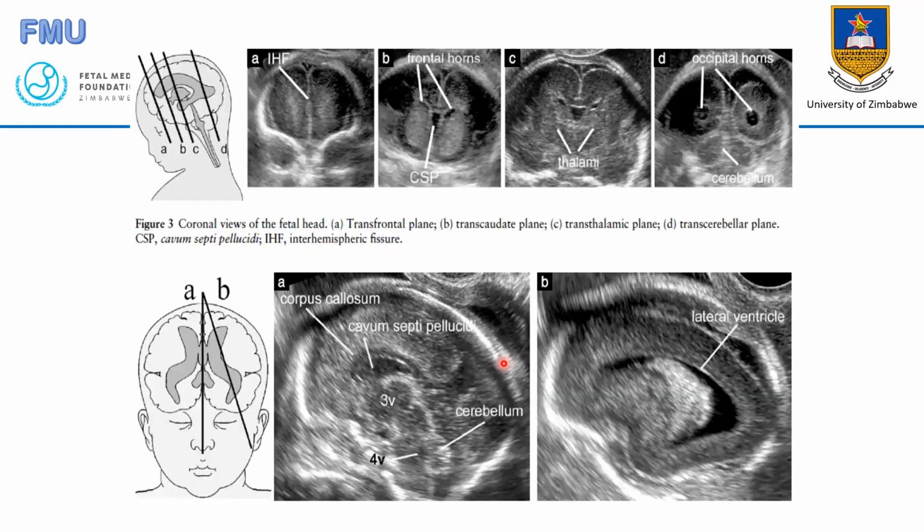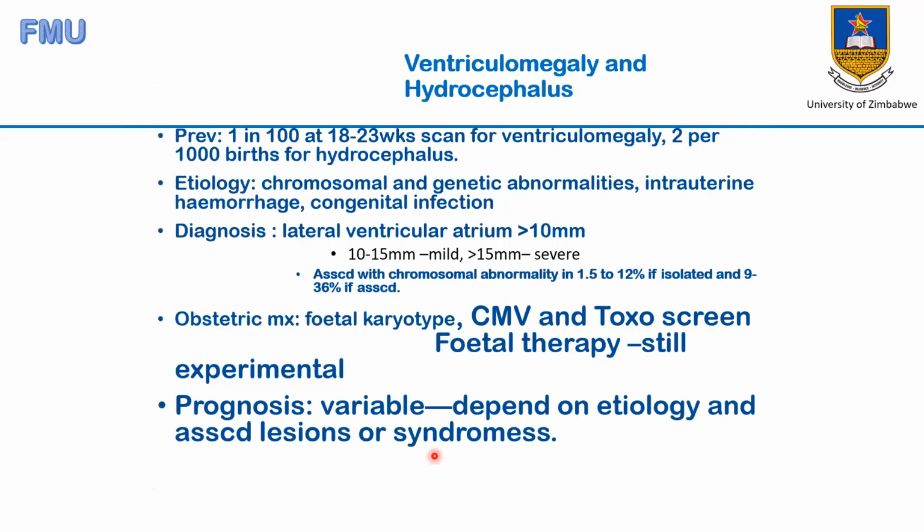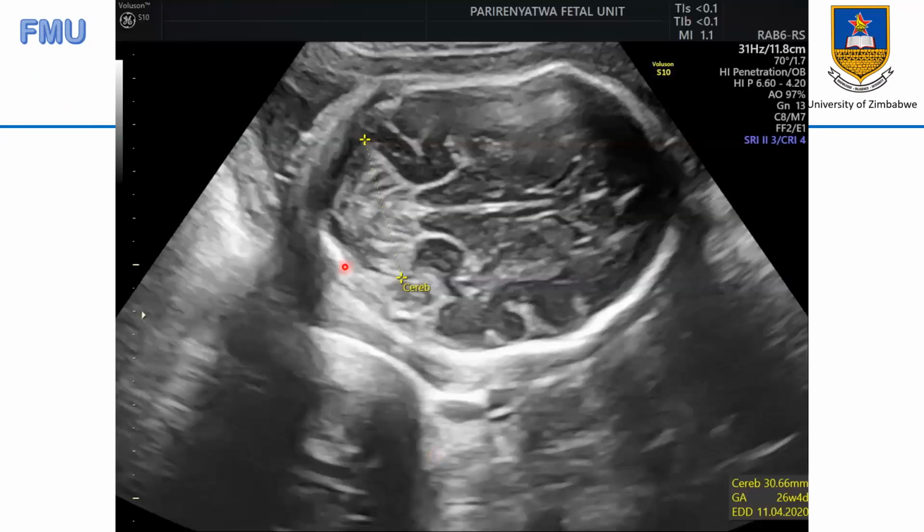But this is a plane which is showing us the sagittal plane. In the sagittal plane, we can still see the cerebellum, the fourth ventricle, and the midbrain here, and these are the diencephalon at the top. There is another plane which unfortunately I didn't put here, which, if we continue to go down, we are going to see the fourth ventricle.